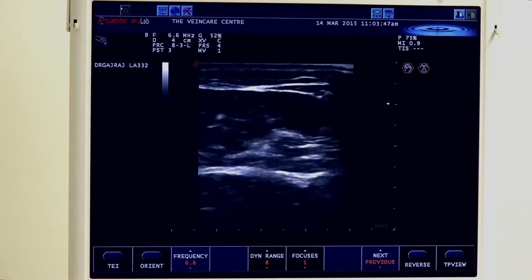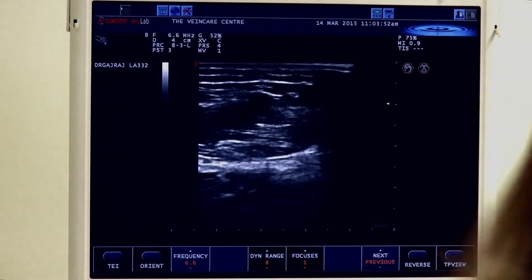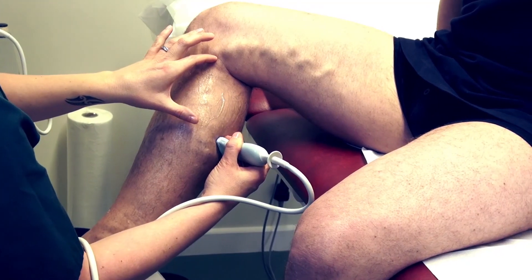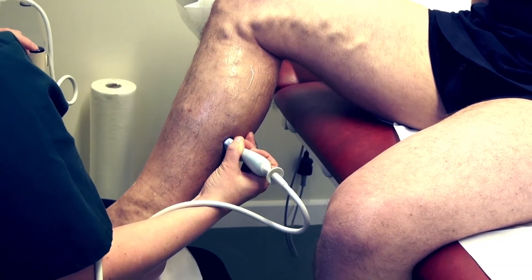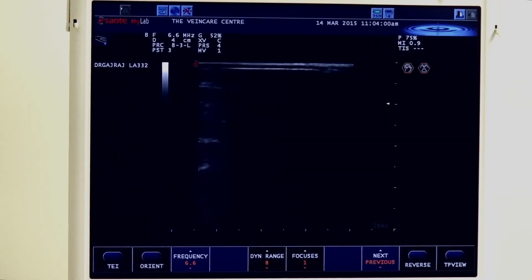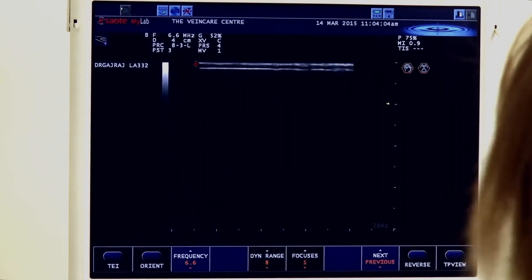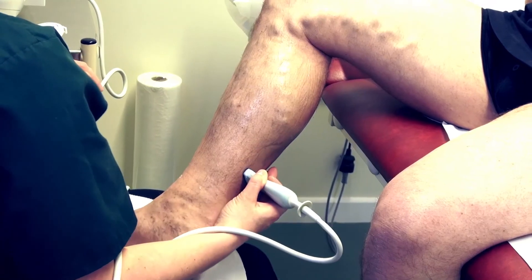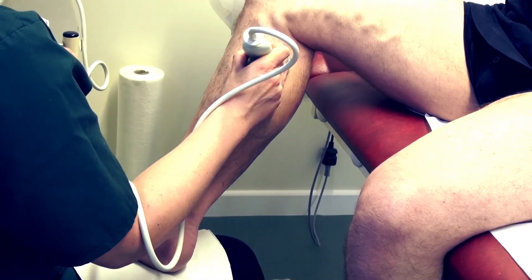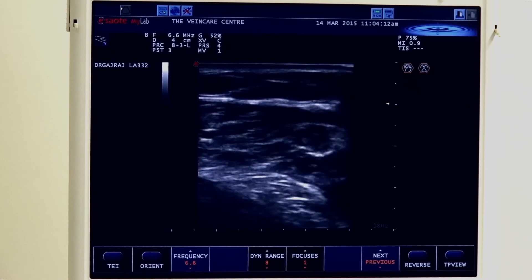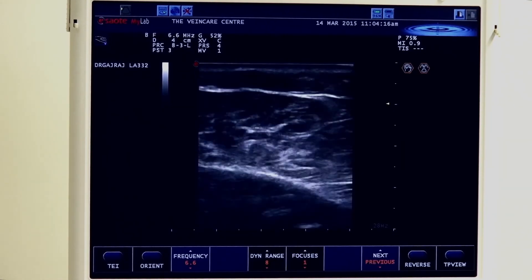As we saw previously, we do have a posterior calf perforator where we would measure from the posterior knee crease distally. But we've already assessed that that vein demonstrated an insignificant level of incompetency and therefore isn't significant.